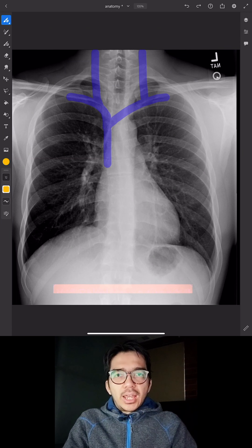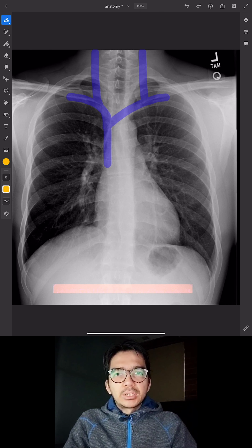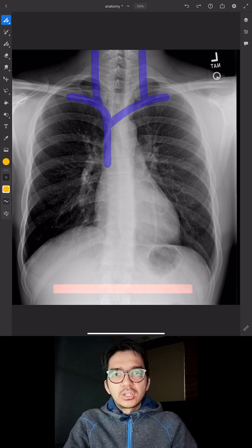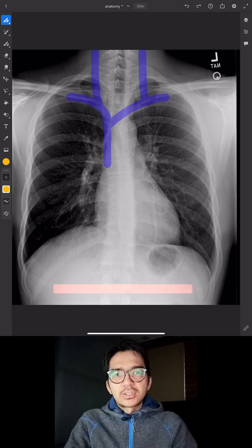Hey everybody, this is Rishi. In this video, we're going to be talking about central lines. I'm going to talk about how to identify the position on chest x-ray, and we're going to talk about a couple of complications that you can see on chest x-ray.